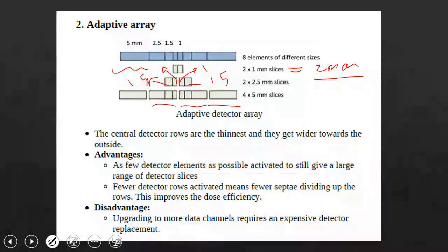So for them, these matters have become expensive, as they might need to replace the entire module or the entire detector if there is an error or some issue. They cannot simply do a replacement or switch from the inner detector to the outer detector, depending on where the problem is.